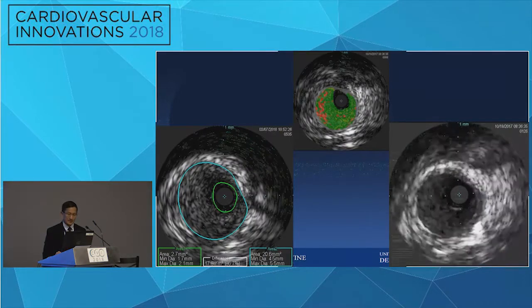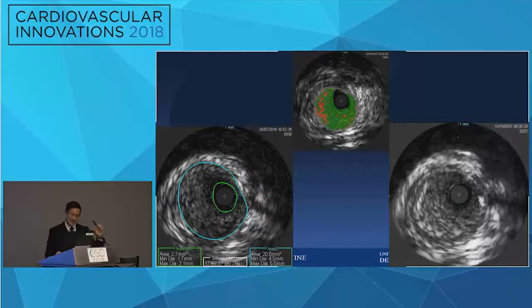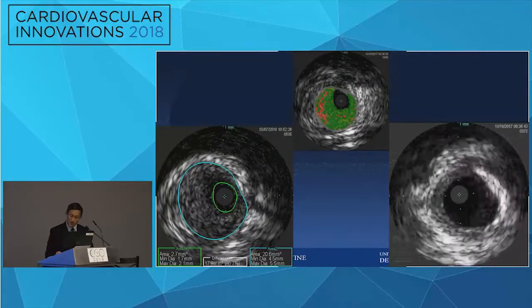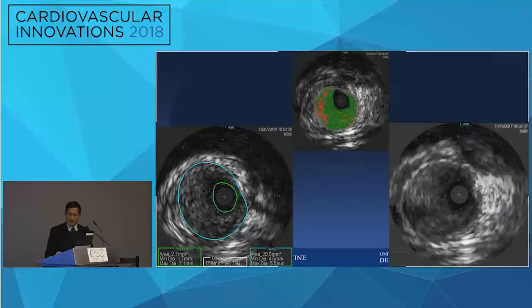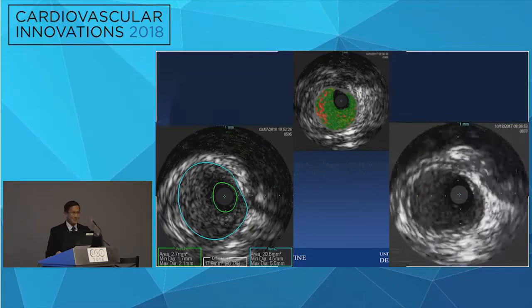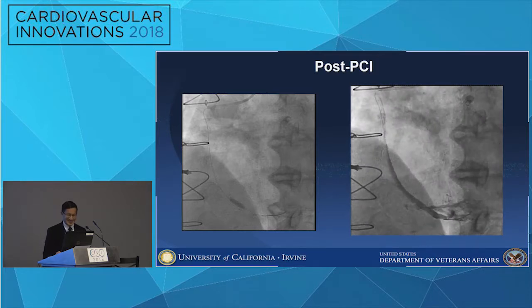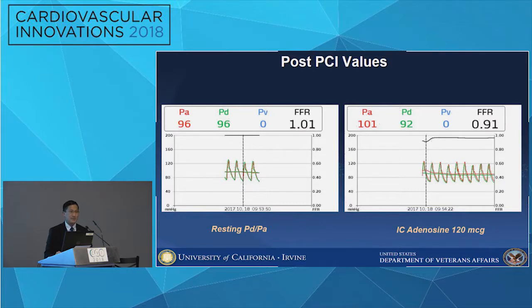Well, when you did an IVUS on this lesion, you found this highly significant 86% stenosis, very focal. They tend to be very focal lesions that have wide exit angles. These are the ones that tend to have iFR, FFR discordances. So do you want to treat this or not? Most people would want to treat this, right? And so this is an easily treated lesion. You balloon it, you take care of it, and then afterwards, both the iFR and the FFR are normal.